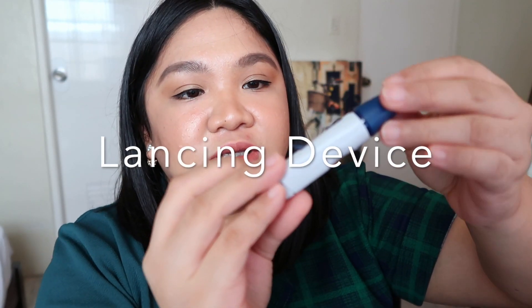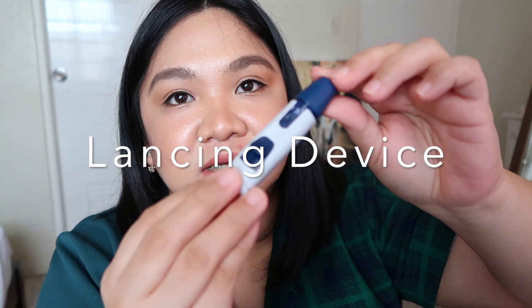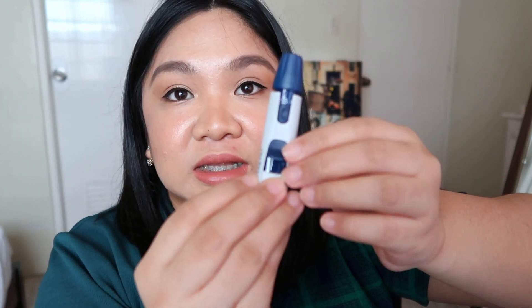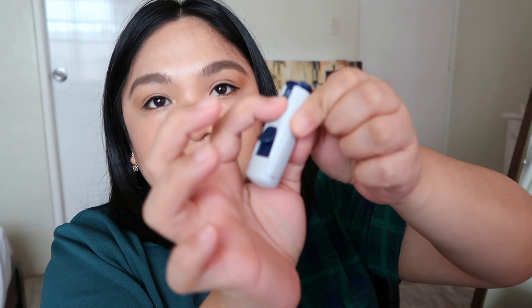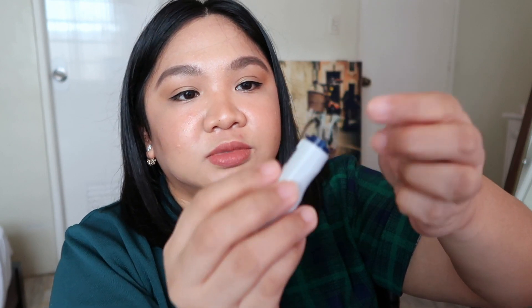We have the lancing device — this is the One Touch lancing device. This is basically the needle. This is the cap, the cover. You can put the needle or your lancet here. This is the cocking device, so you pull it down and then you press — there you go. When it's pressed, the needle will hit the fingers. That's the lancing device.